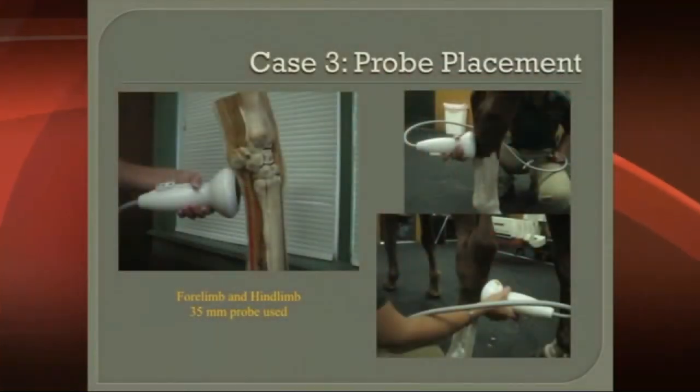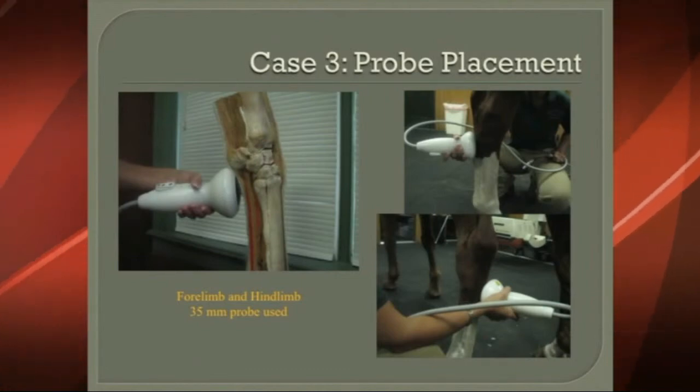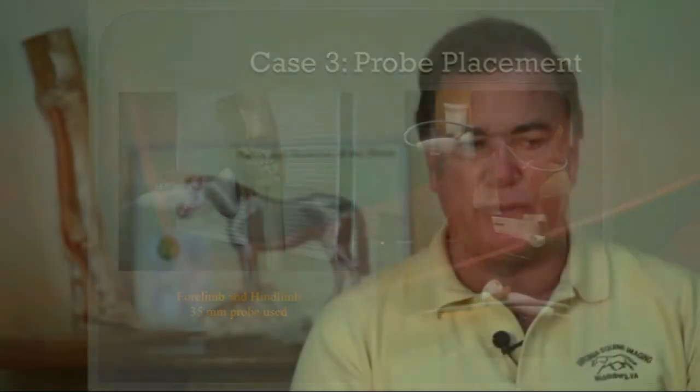This is what the probe placement looks like. On the right, on the hind end, you can see the probes placed to reach the ligament, sometimes coming at an oblique angle. On the left, you can see a forelimb being treated as the probe approaches the origin of the suspensory ligament in the front limb.